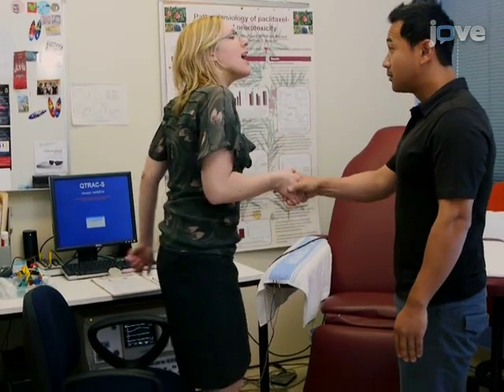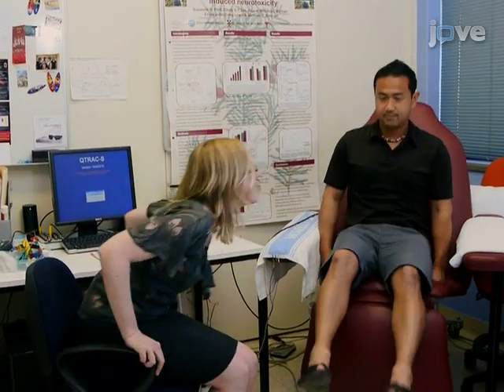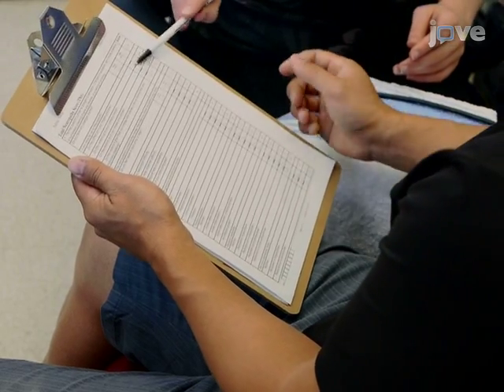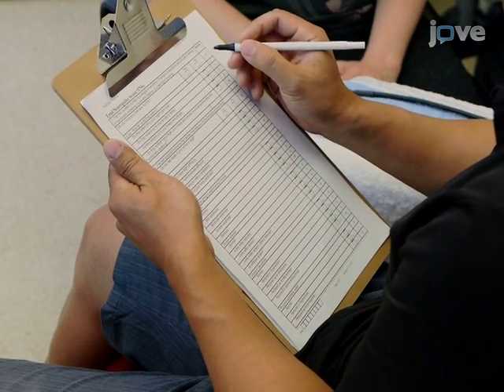For this study protocol, patients are typically referred by an oncologist for baseline nerve excitability testing prior to commencement of chemotherapy. All study procedures should be approved by a hospital or institution internal review board. Screen patients to assure they have no history nor baseline neurophysiological evidence of peripheral neuropathy, that they have not received prior neurotoxic chemotherapy treatment, and have no contraindications for excitability testing.